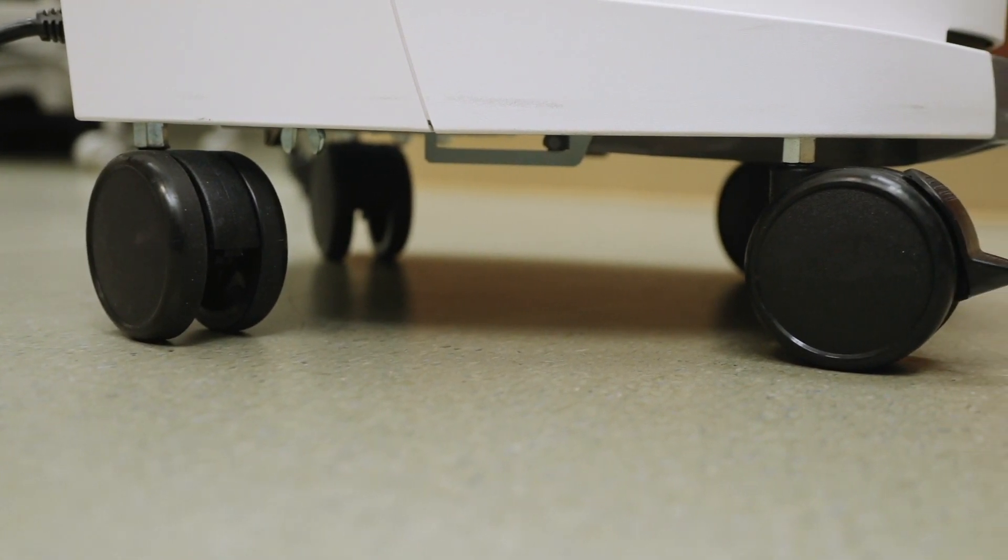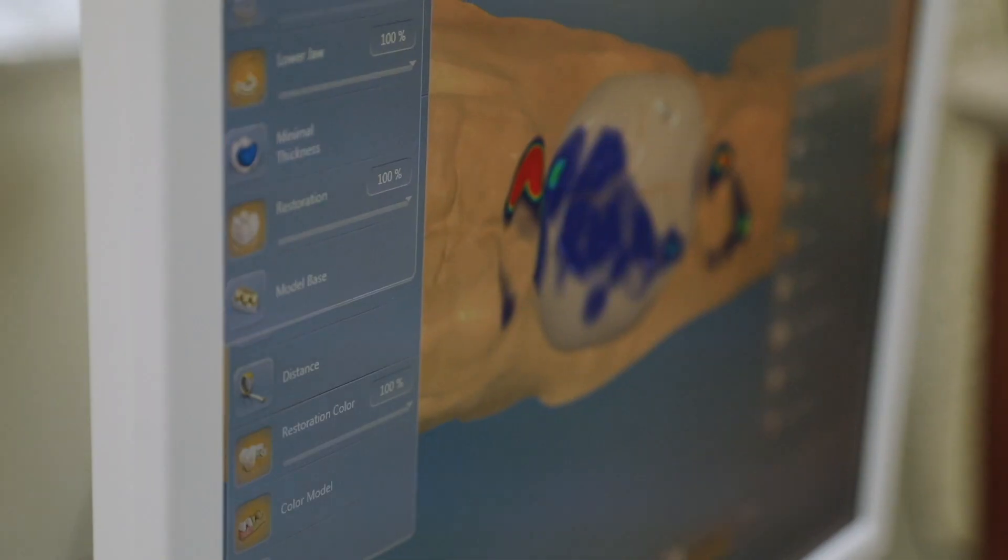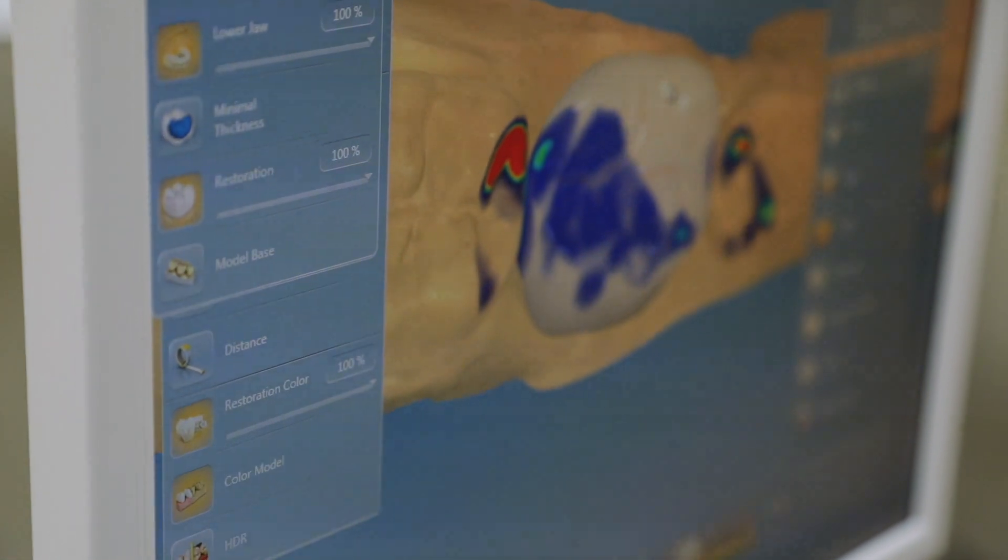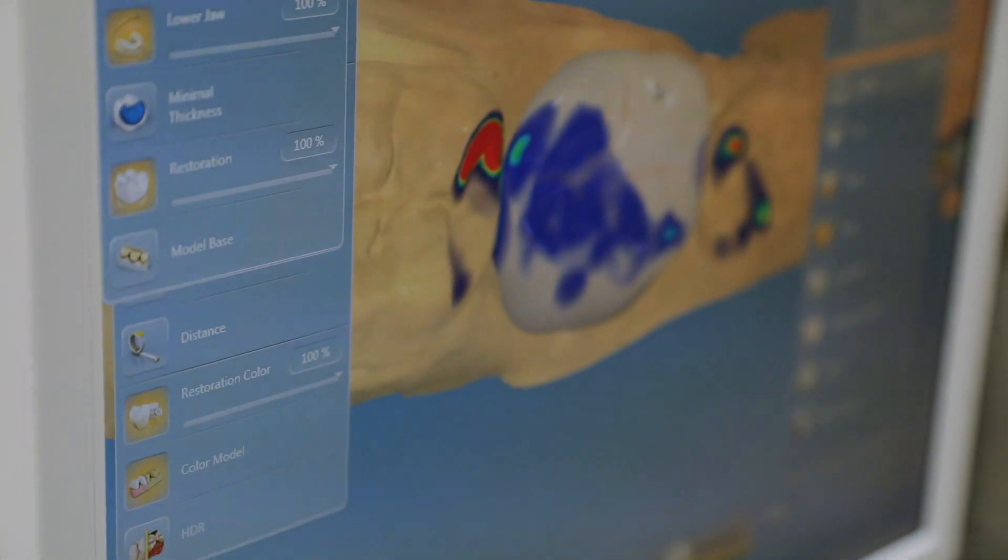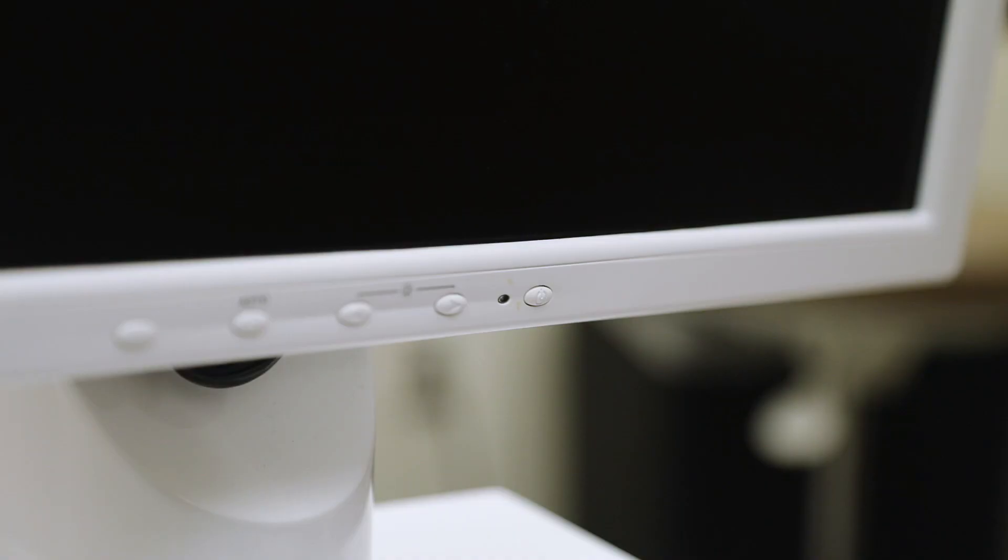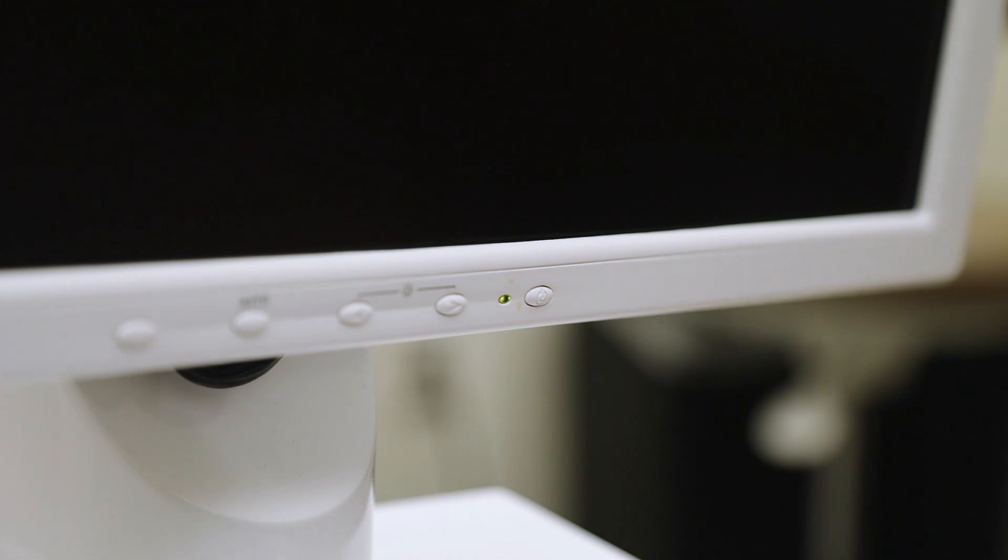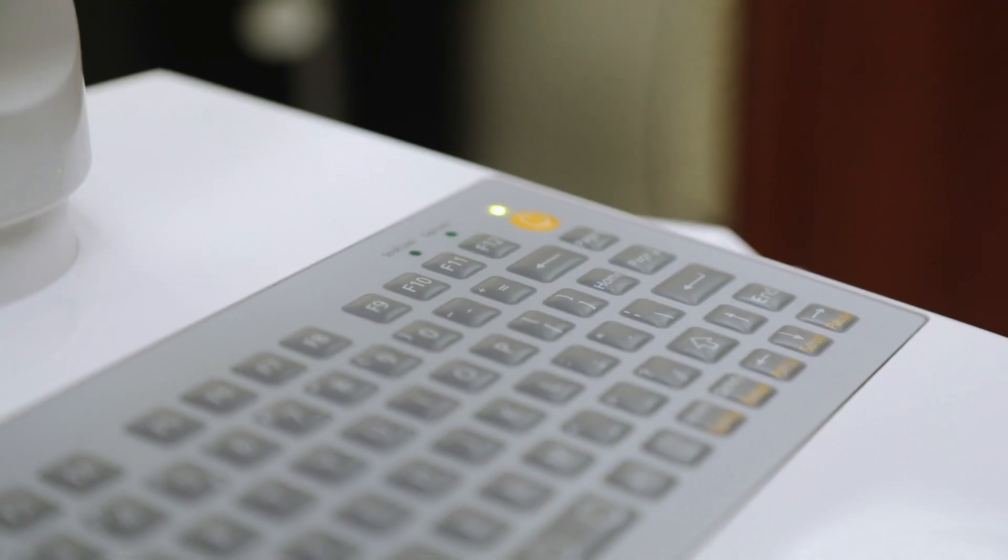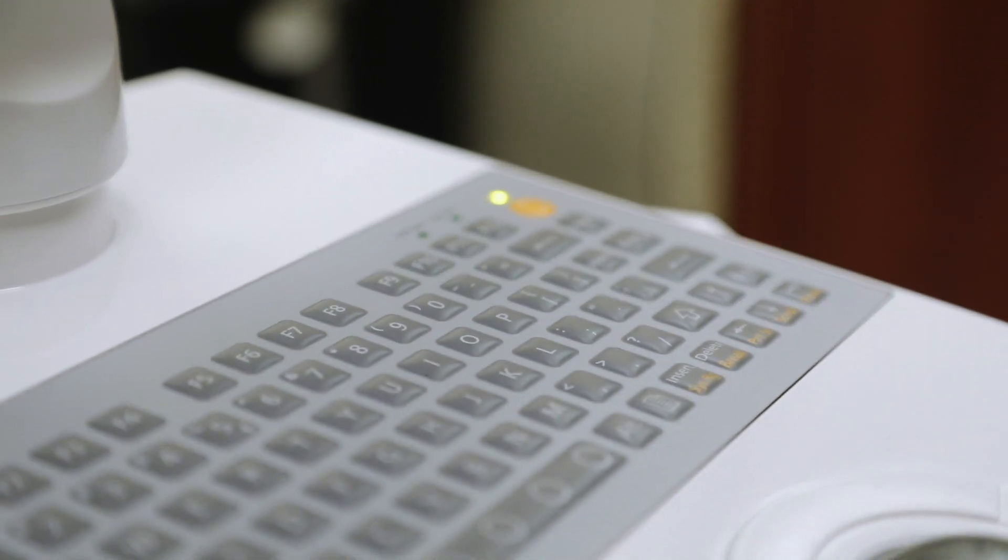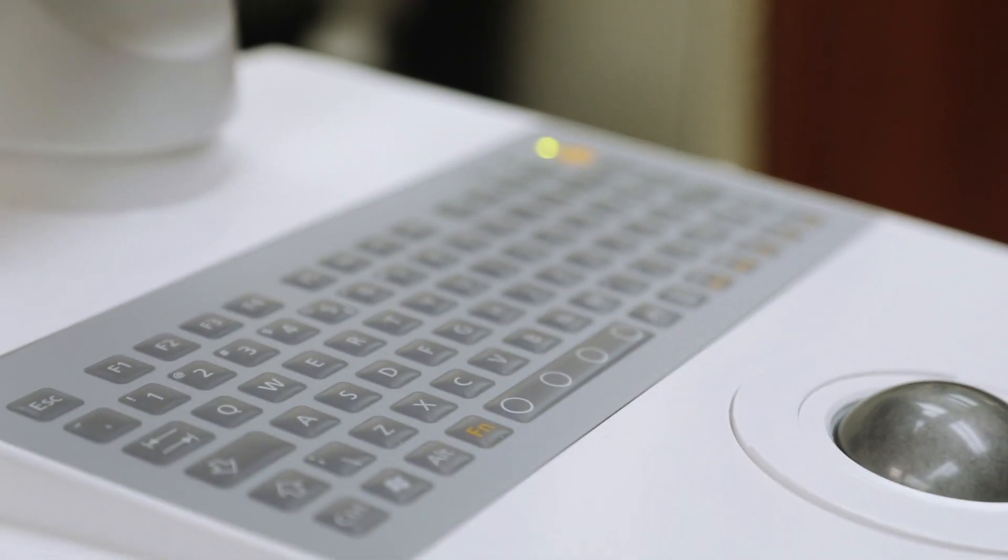On top of the base is the monitor screen. The screen can easily be turned on and off by hitting the screen power button. Below the screen is where you will find the keyboard and trackball for the machine.